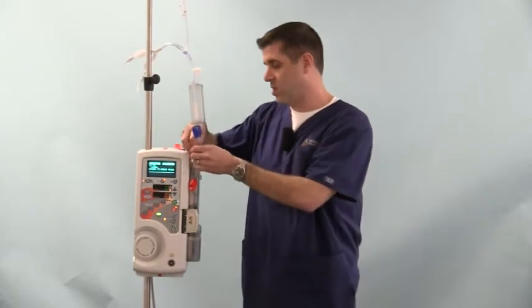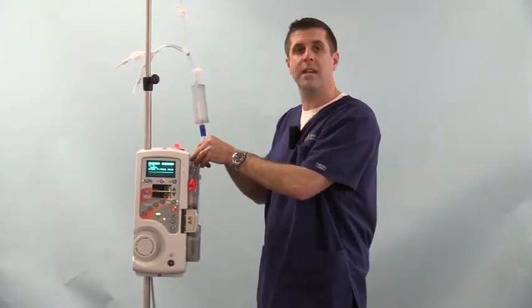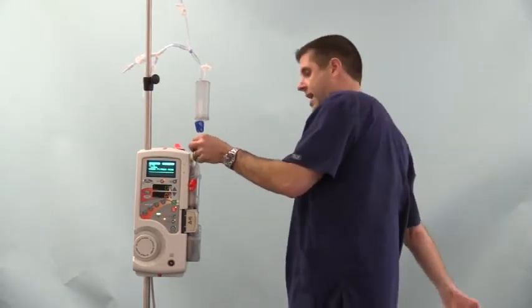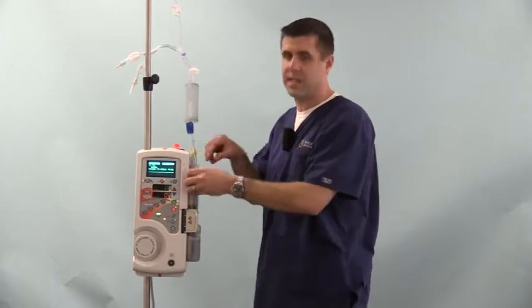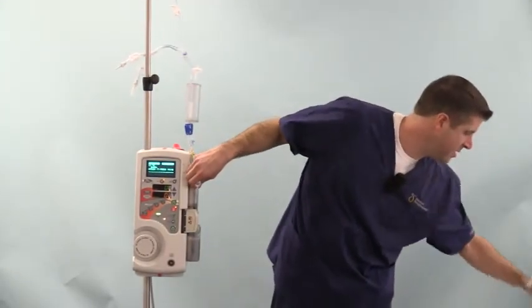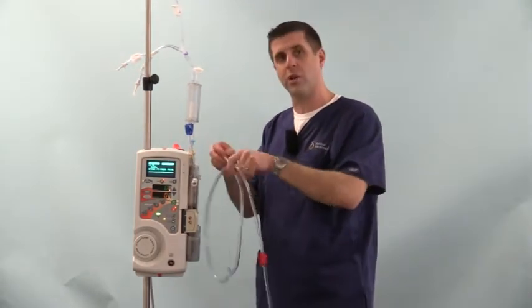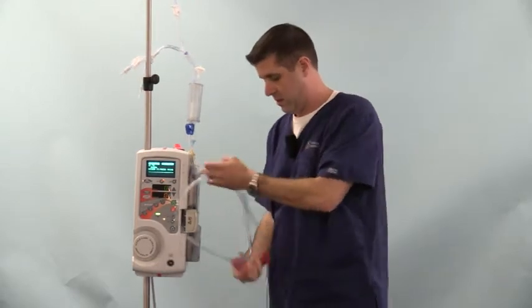Now I'm going to connect the return line, and those caps are color coded yellow. Again, the connections are all unique, so you can't connect it wrong. And I'm just going to remove the 2 yellow caps and twist those together. Now I'm going to connect the patient line and go through the prime sequence. The patient line is color coded red, as was the cap on the cassette itself.